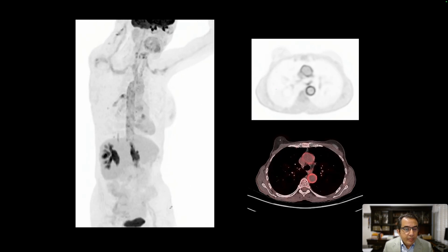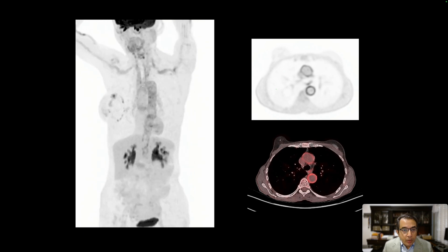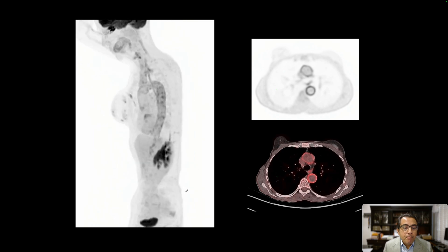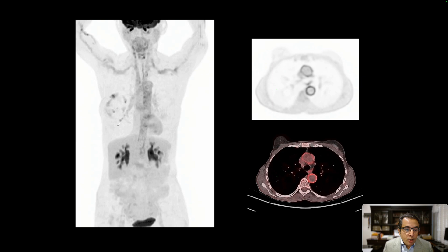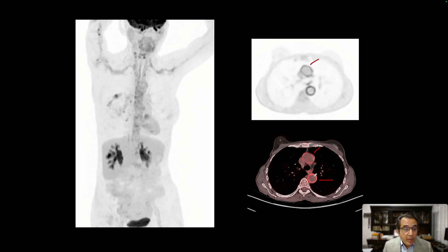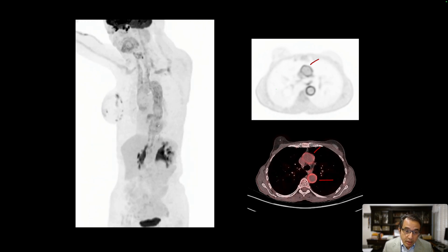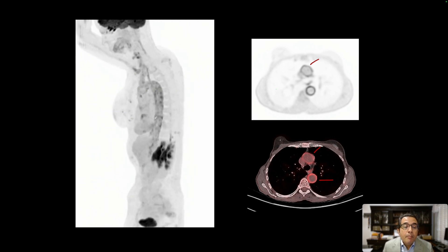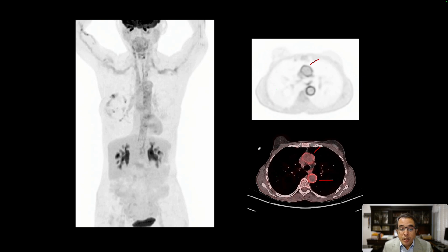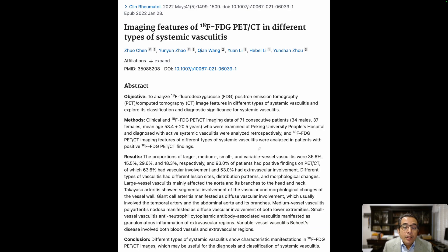Here's our next patient. Looking at the rotating image from their FDG PET-CT study, they had a lung nodule that was not FDG-avid. The most important finding is uptake in the large vessels — specifically the ascending and descending thoracic aorta — with mural thickening and FDG uptake suggesting large vessel vasculitis. There is increased uptake in the aorta and its branches proximally, representing inflammatory uptake. A good article on this topic is: 'Imaging Features of FDG PET-CT in Different Types of Systemic Vasculitis.'